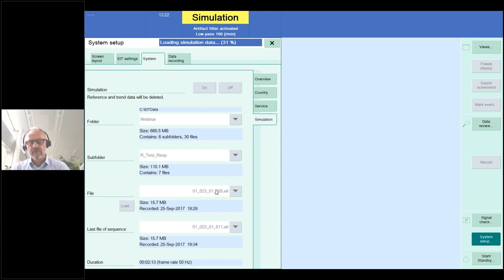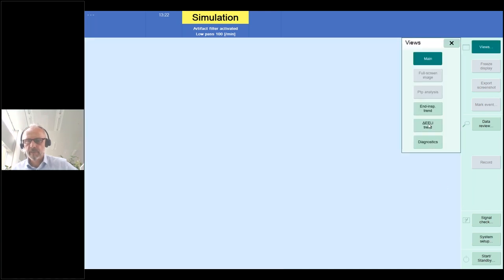But that was also a post cardiac surgery patient where the dorsal ventilation was low. But this patient, I won't go and change the color scales, but I can tell you that in this patient, there was no presence of those purple dorsal spots. So certainly a patient without pleural effusion.